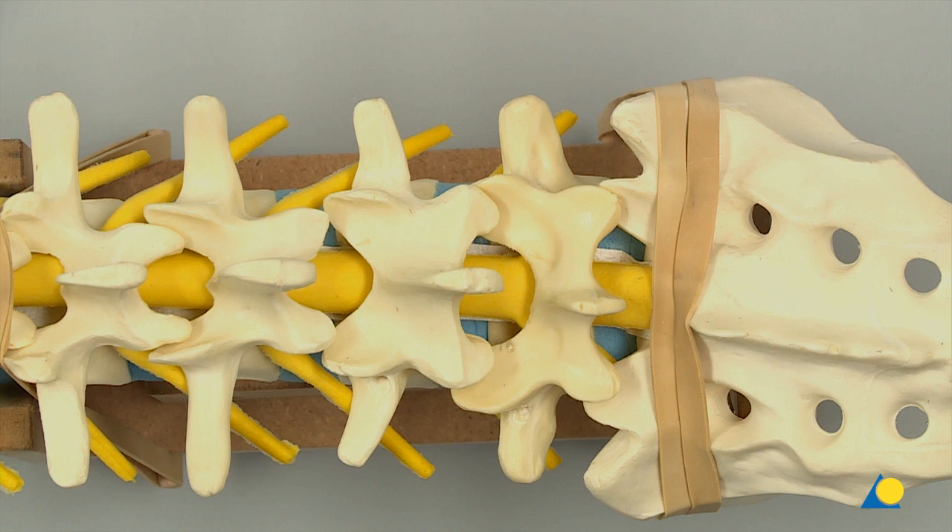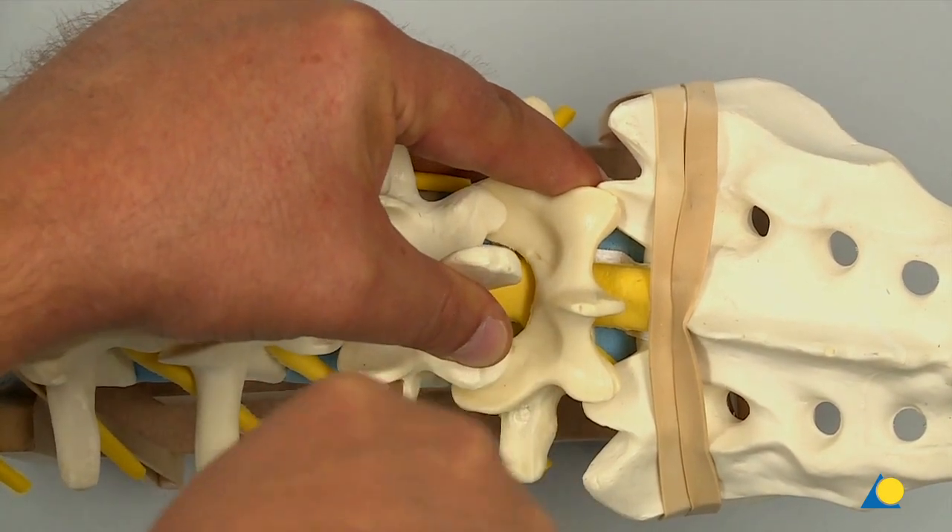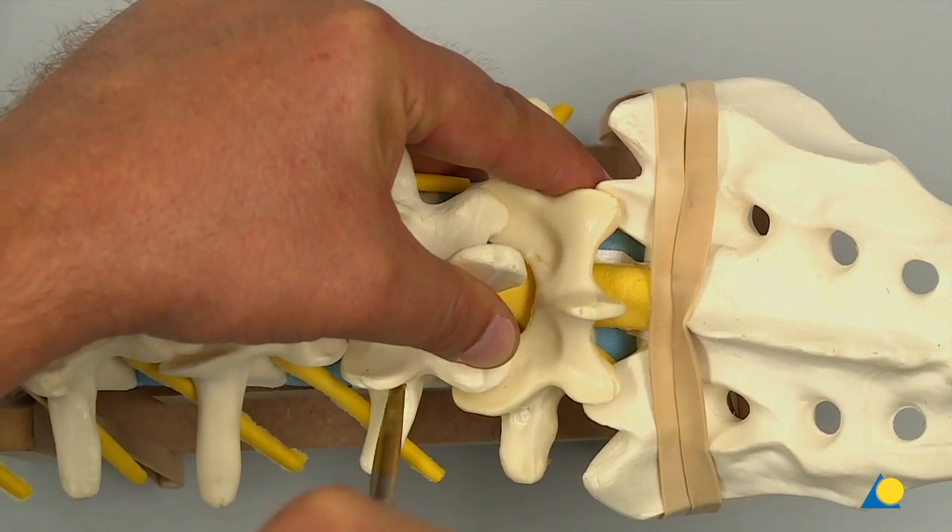When using a curved pedicle finder, aiming it laterally for the first 15mm helps to prevent medial penetration into the spinal canal. Once it has passed the posterior wall of the vertebrae, the pedicle finder can be aimed medially to obtain a more convergent screw trajectory, which allows for a longer screw and better purchase in the bone.